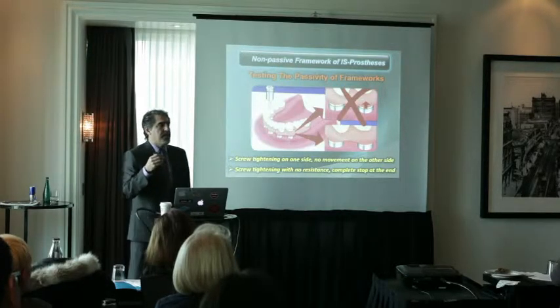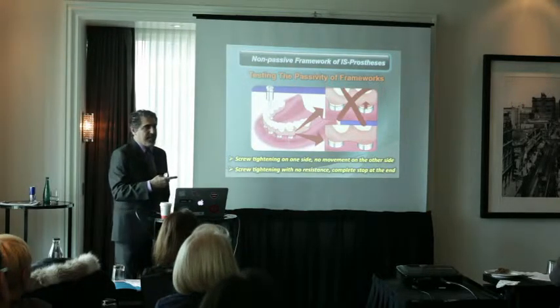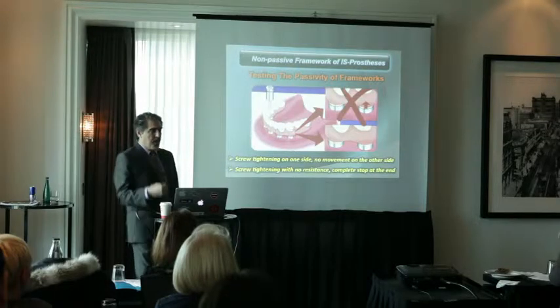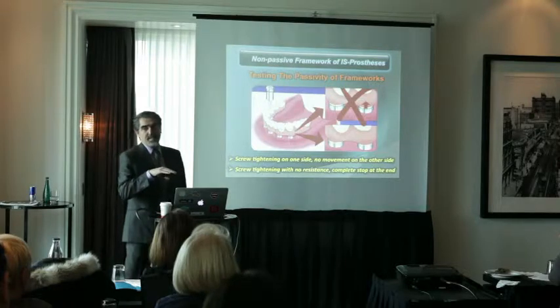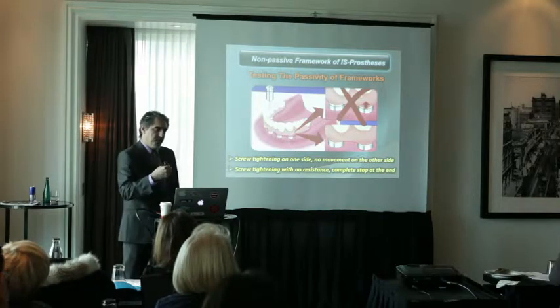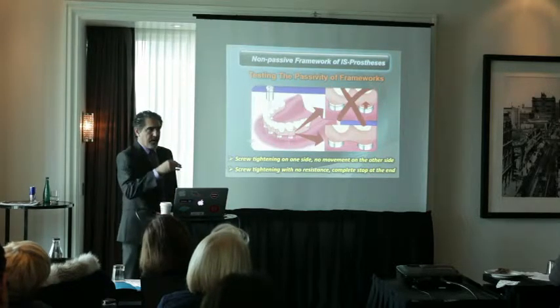You don't feel the gradual tightening of the tissue. Now, there is a noise in this method, and that's the soft tissue. Sometimes the soft tissue is not going to let your screw go all the way down. So for implant level prosthesis, it's difficult to know if the abutment is tight with this system, feeling if the screw is getting tighter gradually or all the way in one second.